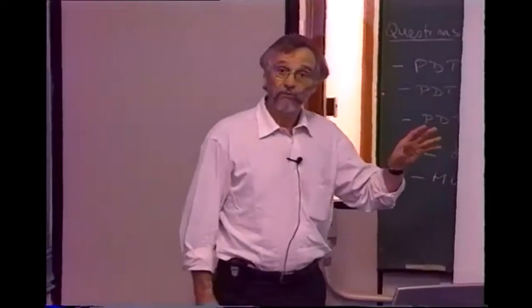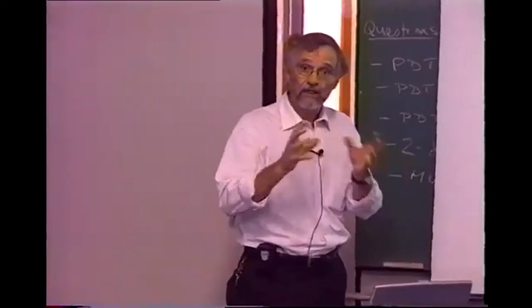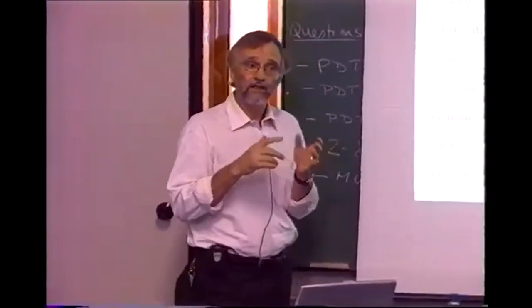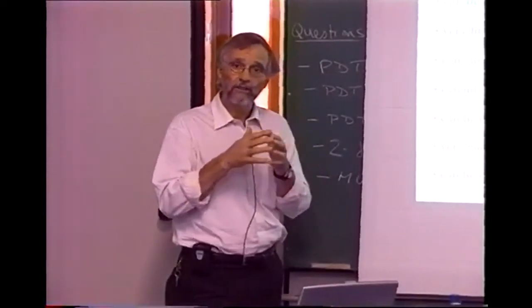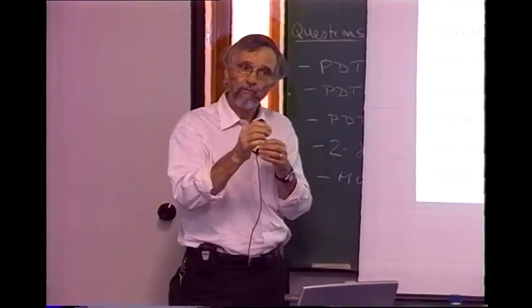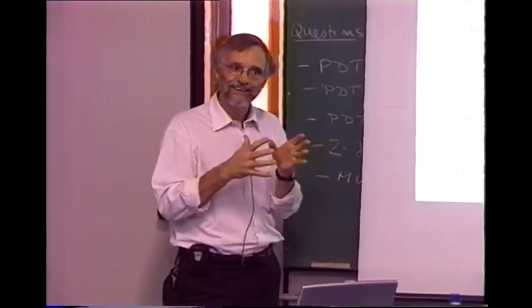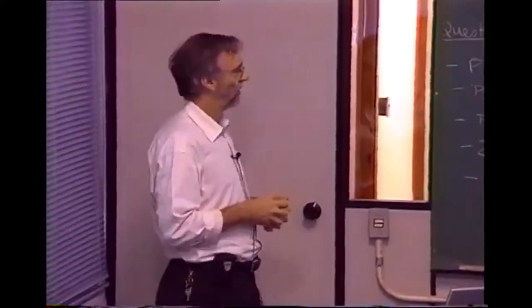We're doing the treatment of the prostate with patients who've already had radiotherapy. You combine it with surgery. It doesn't matter if the patient has had chemotherapy or will have chemotherapy. It's easy to do, you can use PDT and there's no bad interaction between these. Probably that's because in the case of radiotherapy and chemotherapy, the radiation and the chemo are targeting the DNA, whereas PDT is not targeting the DNA, so you're hitting a different biological target. So you don't have the additivity of the treatment.